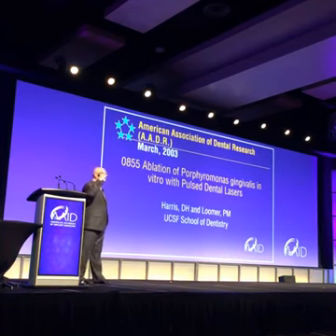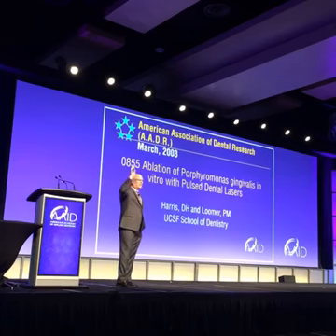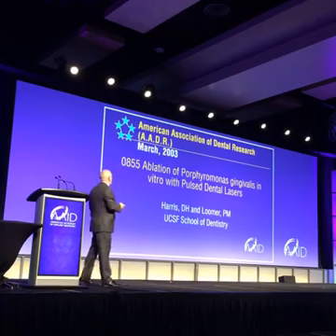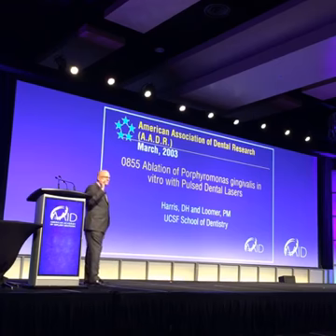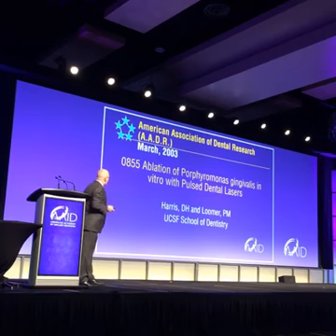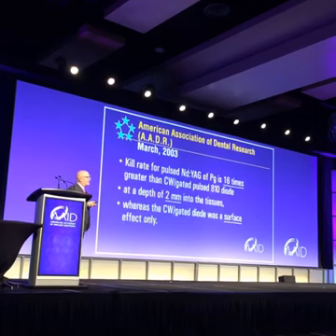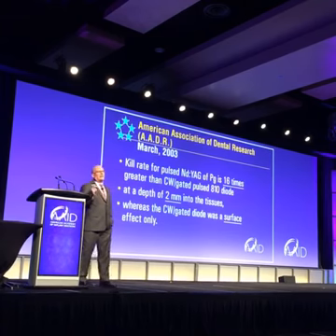How many here use diodes to do decontamination in their offices? A lot of people do. It's like a big thing now. The problem with the diode is it only kills bacteria at the surface. It doesn't extend past the point of contact. The Nd:YAG can extend past the point of contact up to 2 to 4 millimeters. There was a study done by Dr. Dave Harris looking at P. gingivalis, and what they found was the kill rate for the Nd:YAG was 16 times greater than that of a diode.